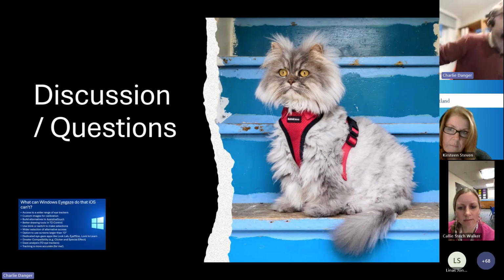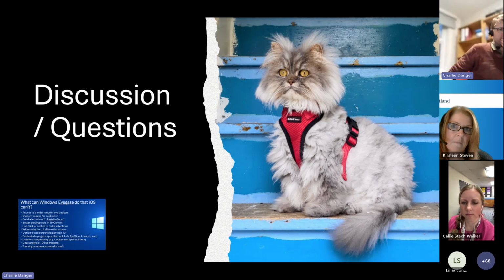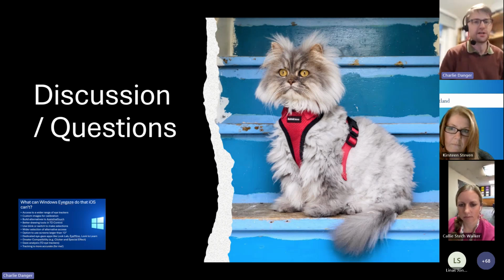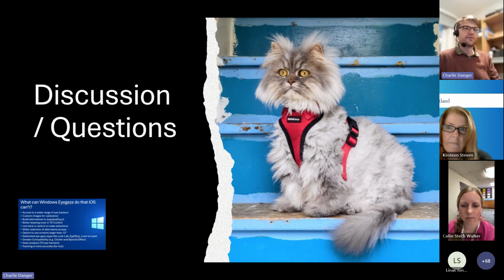They may even come up with a different way of calibrating, because we've been following this dot around for years. There's the dot, but there potentially are other ways to calibrate. For example, maybe you'll watch an advert for an iPhone, and it's able to know where you're looking while you're watching the advert, and then you'll calibrate based on that.